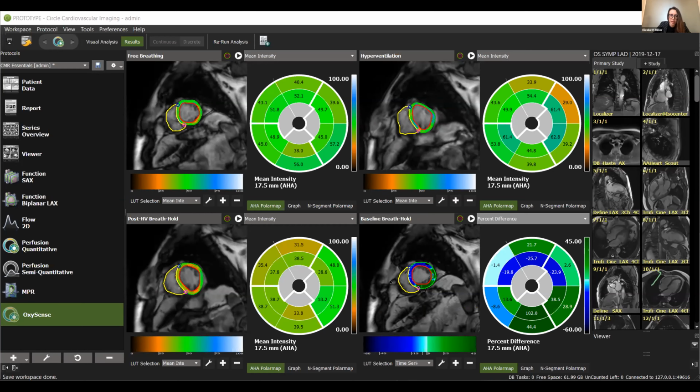So this is the BMOR that you see in all of our publications. This is showing this currently. And so we can scroll through the entire cardiac cycle. There's contours in every cardiac cycle, contours across our acquisition. So this is a 4-minute acquisition, 2 minutes of free breathing, 1 minute hyperventilation, 1 minute of breath hold, and it spits out all of this information.